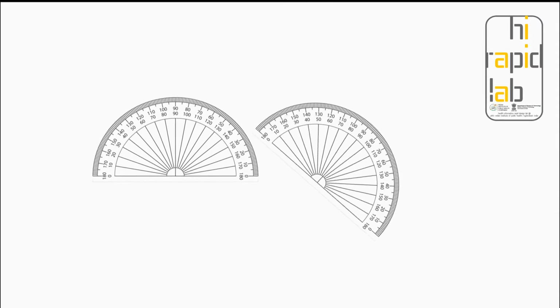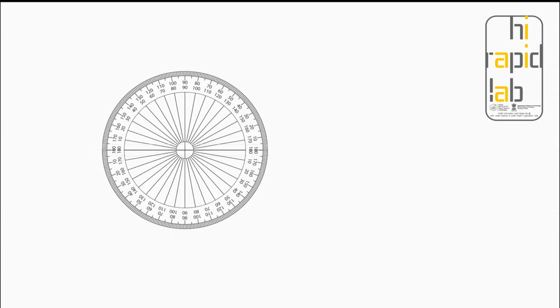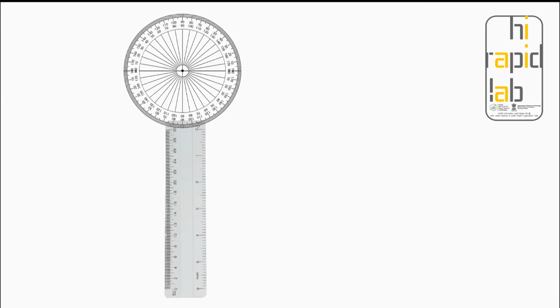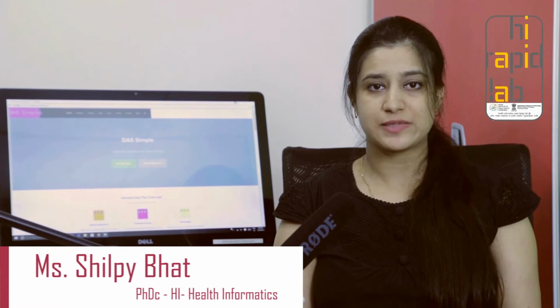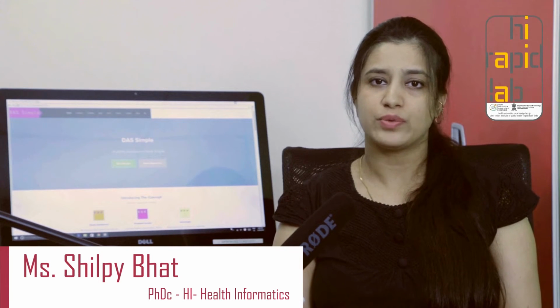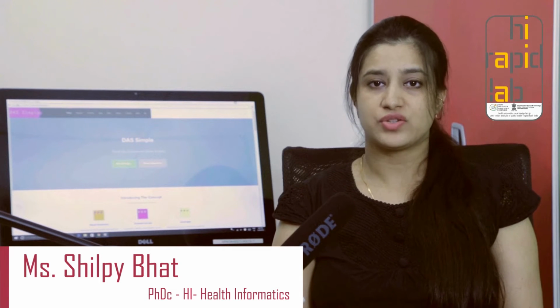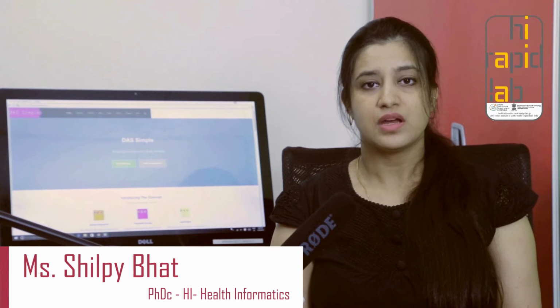Technically, this is known as half-circle protractor. If you add up one more, it becomes a full-circle protractor. And if you add up 2 extending arms, it becomes a goniometer. The 2 arms are known as the stationary arm and the moving arm. This is perhaps not the textbook explanation of goniometer, but I hope you get an idea in a more imaginative way. A bit of history, if you don't mind. The earliest description of a goniometer was apparently made in 1538 by Gemma Frisius. I have one to show you, and this is how it looks like in real.